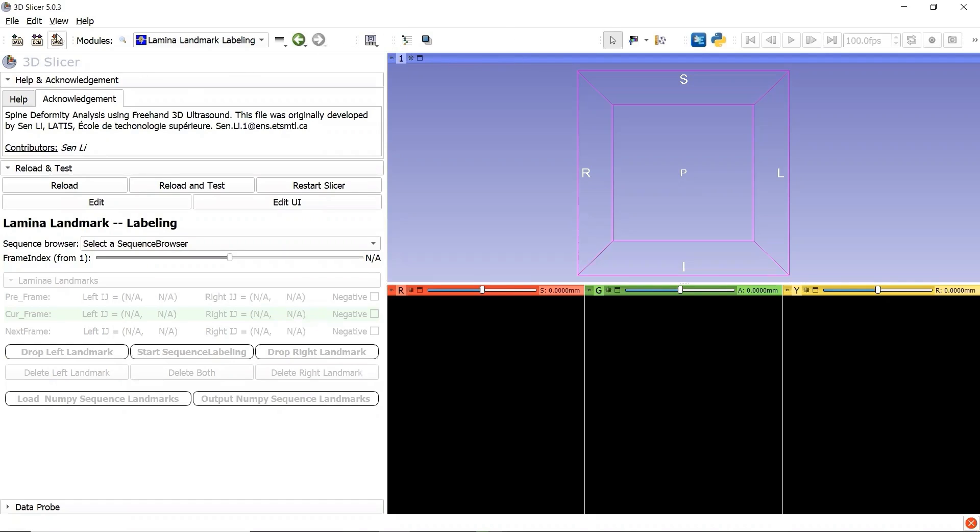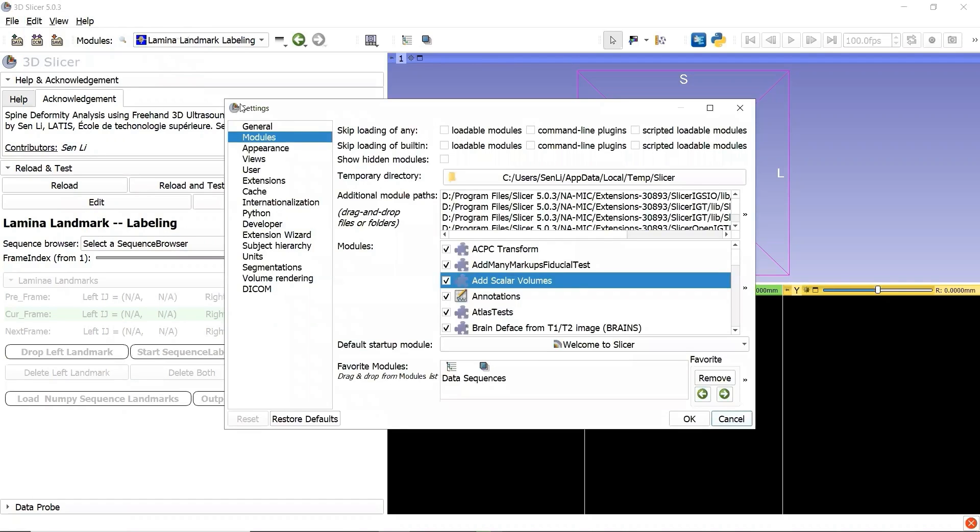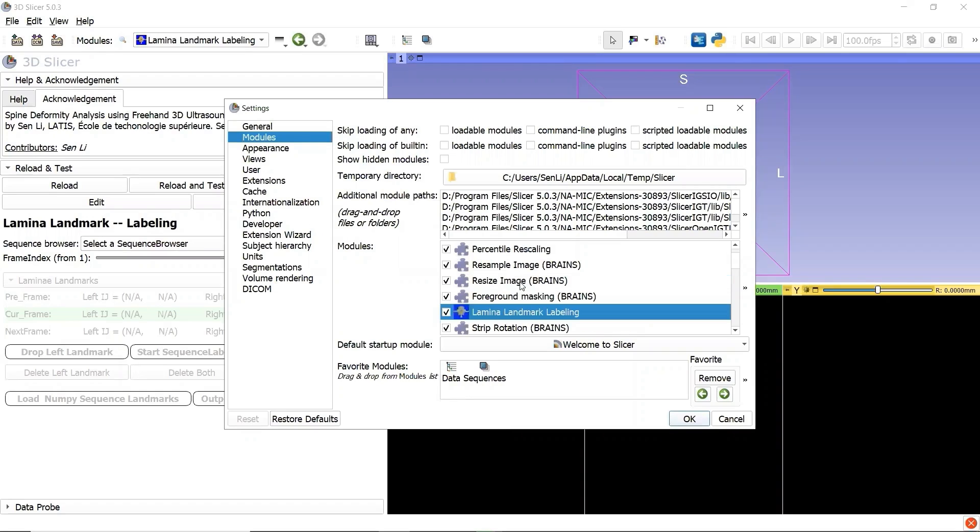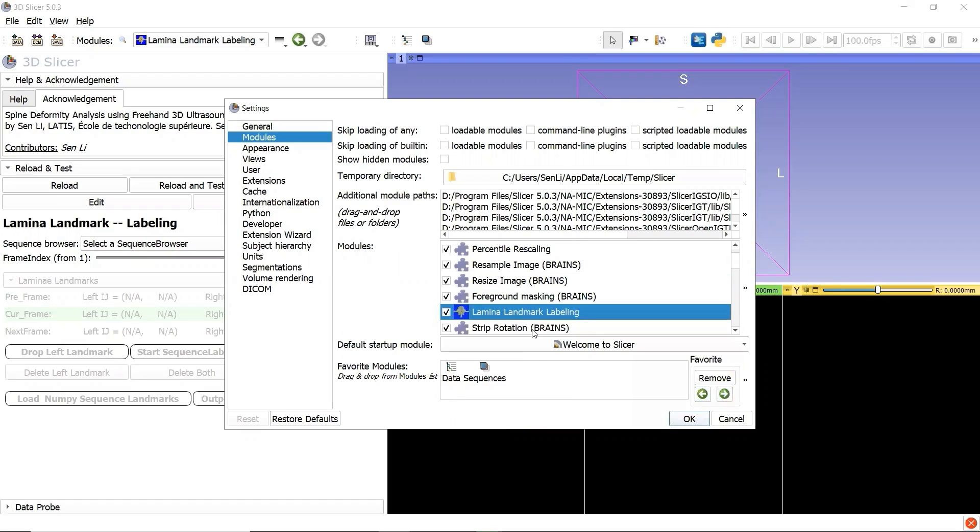Let's go to the menu bar Edit, click Application Settings, go to Modules, click inside the module list, and press button L to find the module Lamina Landmark Labeling. Then drag and drop from the module list to the favorite module list and click OK.